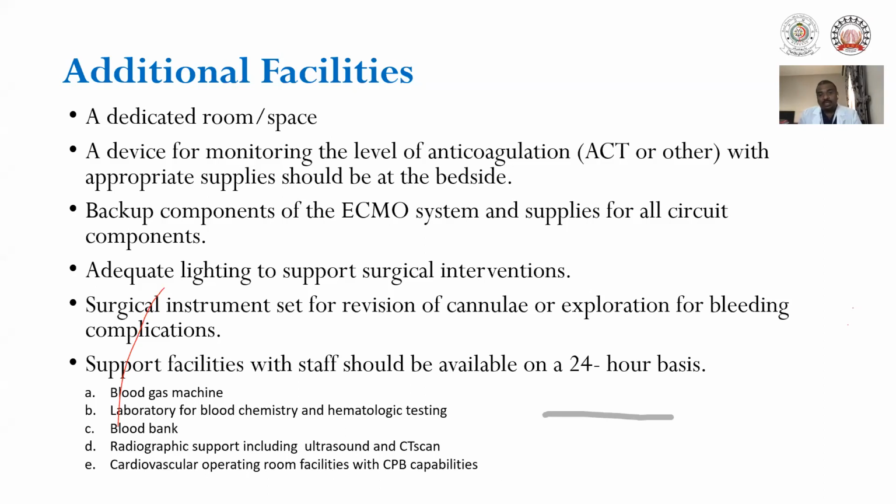Adequate lighting to support any surgical interventions, because if there is any bleeding or such things, it may require frequent changes or switching as well. A surgical instrument set for revision of the cannula or exploration of bleeding complications. Support facilities are very, very important.